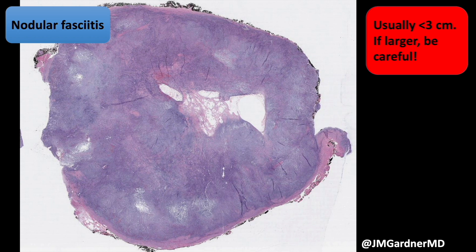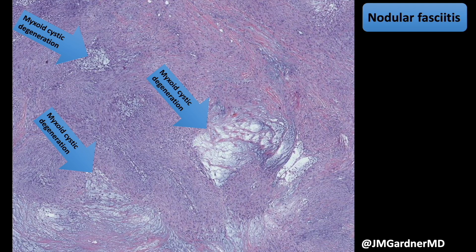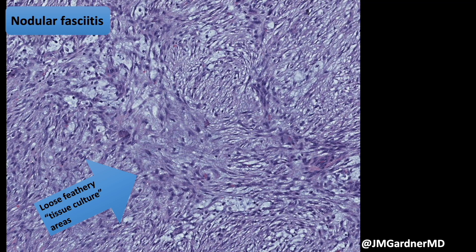I said 'tumor' because even though we used to think of this as a reactive myofibroblastic process — because it looks so much like reactive myofibroblasts — it turns out these actually have a translocation and are currently considered a form of neoplasia. Here's a closer look at that myxoid cystic degeneration: well developed on the right, more subtle and early on the left. In any of those forms, a myofibroblastic proliferation with myxoid pockets, pools, or cystic change is a great clue for nodular fasciitis.